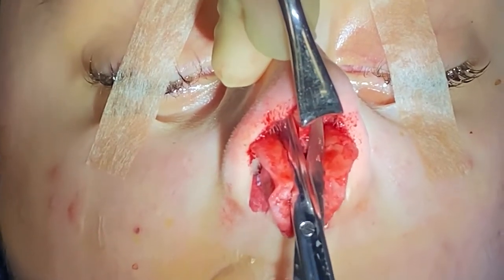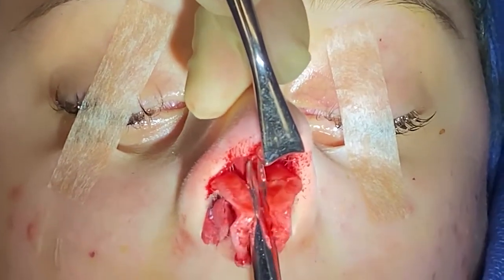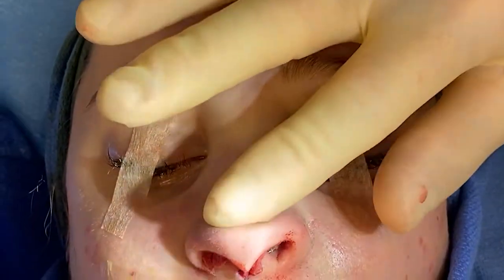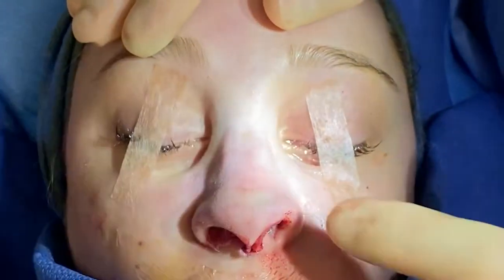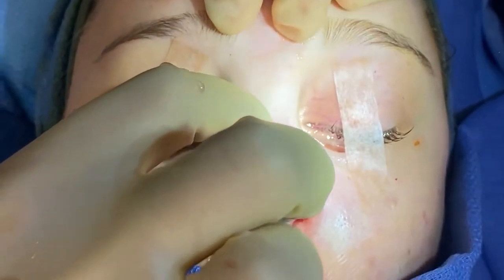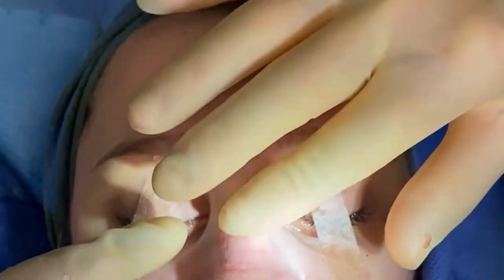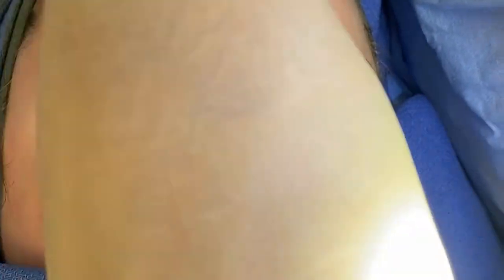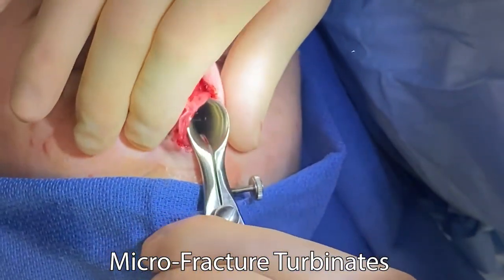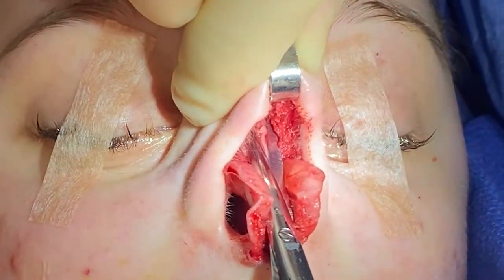In somebody like this I'm going to trim a little bit of the upper lateral. Wow, she now has an open roof — take a feel. You dab with your finger and then feel it — open roof here, yeah, smooth. Then you hear the micro-fracture — I'm just out-fracturing, doing the micro-fracture. I'll do it for the turbinate like that, and it's always a little wider at the keystone area, so I want to make sure.